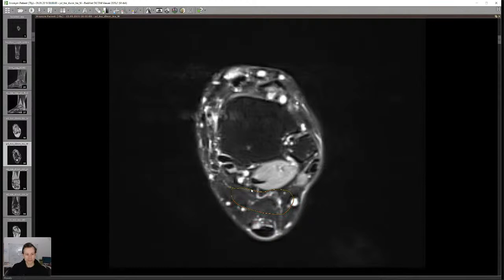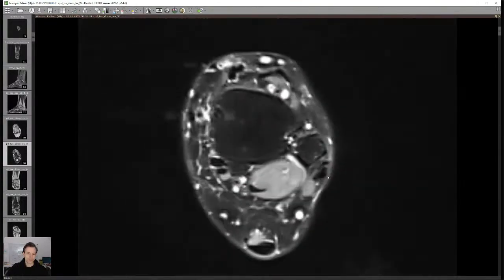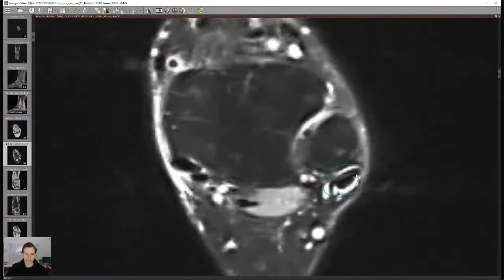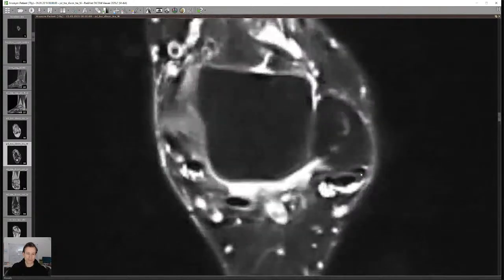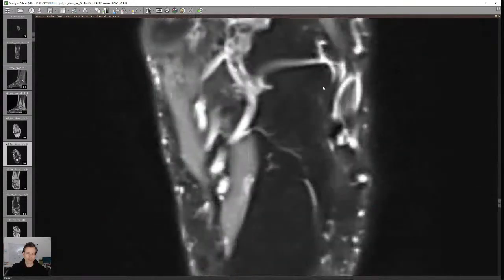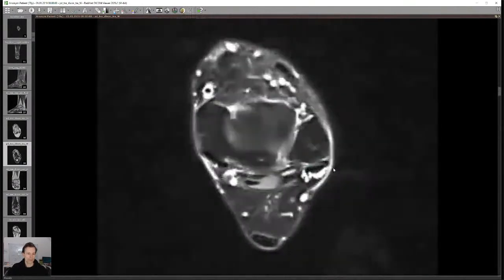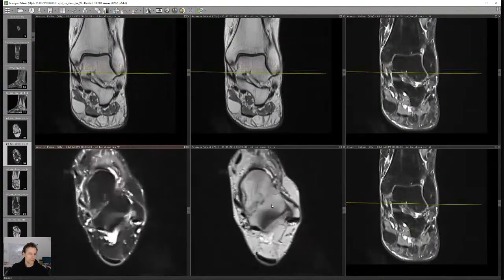Accessory muscles look normal so they don't catch your eye, but mentioning them shows you actually looked carefully. Then the peroneal tendons — we can see tenosynovitis here; this amount of fluid is certainly not normal. The peroneus brevis tendon is clearly flattened and probably split — one portion here, one portion here, like a Mickey Mouse appearance — but they mostly join back together. Very significant tenosynovitis, and then they insert at the base of the fifth metatarsal.